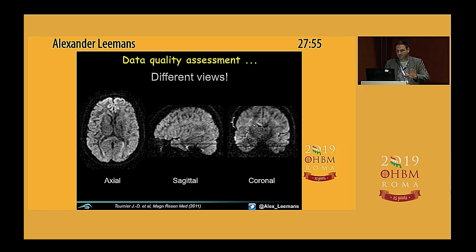And if you go through axially, slice by slice, your brain automatically adapts the dynamic range in which you're looking for artifacts. You will never spot it, right? Especially because it's asymmetric as well. Like it's more over here. Here it's, I guess, okay. But this was a systematic artifact that was not captured in the entire cohort. So that's kind of painful.